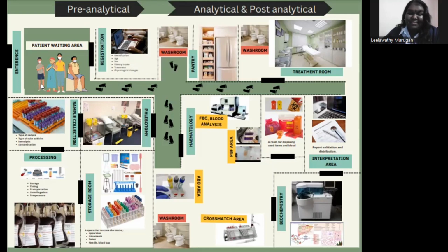To be more understanding, I've designed this workflow also including the working parts here. As you can see here, this is the working parts in our lab. So as soon as patients are registered here, they will be walking through this way and then turn right and then take another right. So they can see another door which leads to a phlebotomy area. In that phlebotomy area, they will be having sample collection by the staff. So basically in phlebotomy, patients will come and the staff will draw blood from the patient to diagnose their disease.